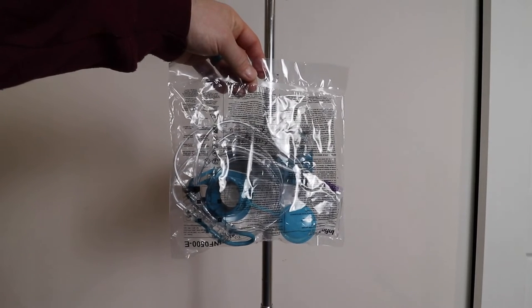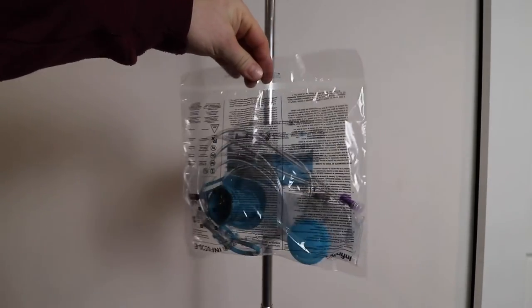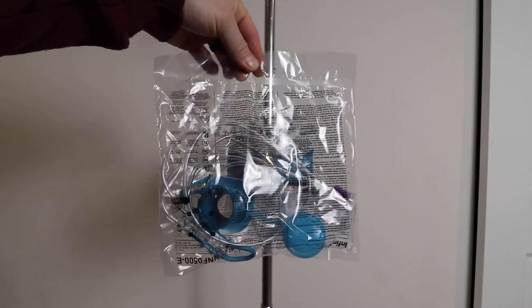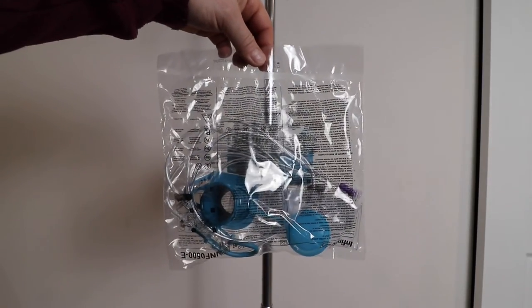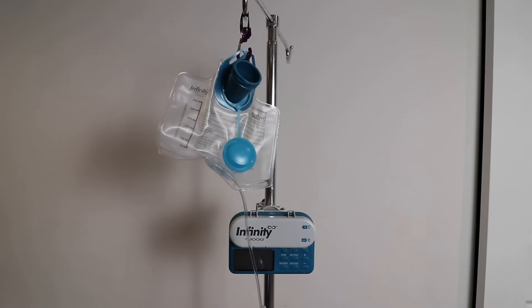The first step is to open one of your brand new feeding bags. They come packaged like this and you open it up and add the formula or the breast milk that you are using to the bag. Once you've opened the new feeding bag, you just fill it with your breast milk, formula, or whatever you're using to feed your child.